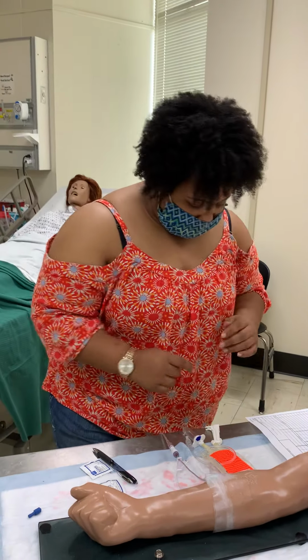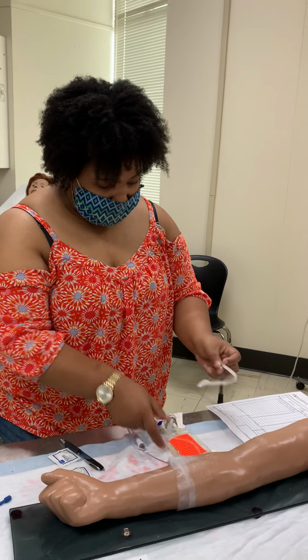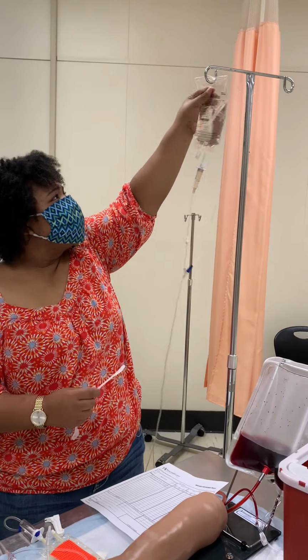Okay. All right. So now I need to lower my primary set.